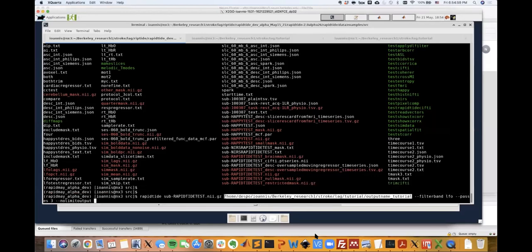This one right here, the third one, is the frequency band of interest. As we've discussed before, the low frequency oscillation band, the band from 0.009 to 0.15 hertz, is our band of interest, i.e. the low frequency oscillation band. So this command basically filters your data to that particular frequency band.